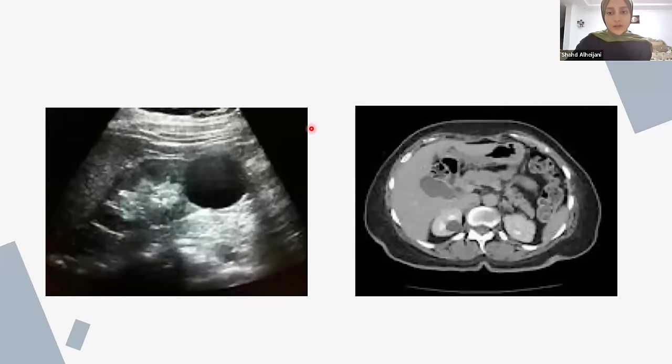So here in this case, again, this is an ultrasound and you still see something, but behind it or underneath it, you see enhancement. Now, you guys didn't take ultrasound yet, but what you need to remember is, remember how I told you, if you have a structure in ultrasound and then you look behind it or under it, it can either have a shadow or it can have enhancement.